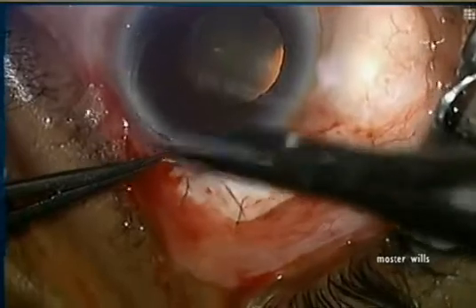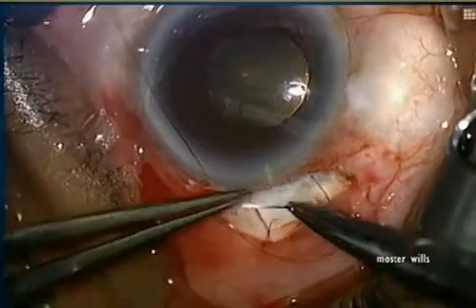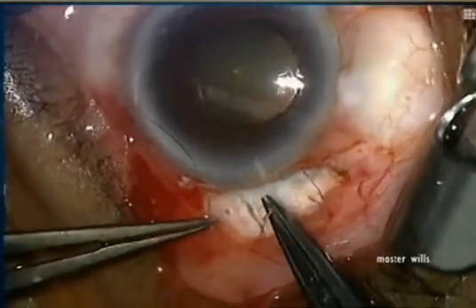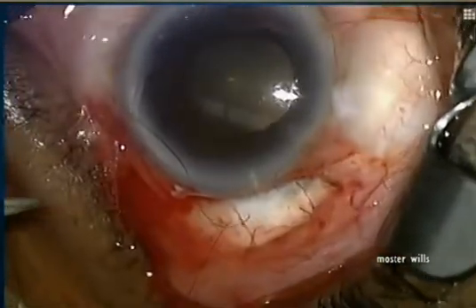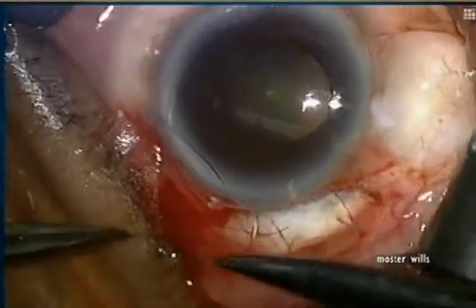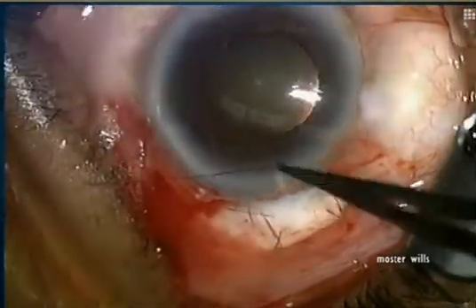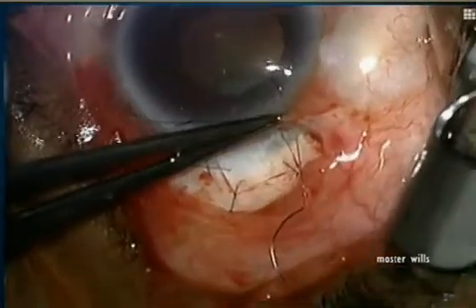We tie the sutures and cut them. For better control in the immediate postoperative period, we use a releasable suture — 10-0 nylon half thickness through the cornea. You take a half thickness bite through your flap to the adjacent sclera, pull it out, then turn the needle around and go back exactly as you came, creating a rectangular knot. You can tie this as tightly as you want — tighter for very high pressure, looser for normal tension glaucoma.